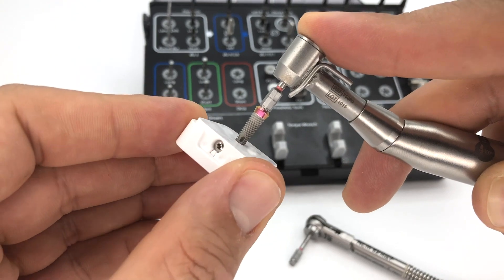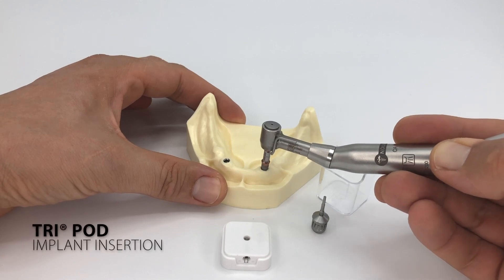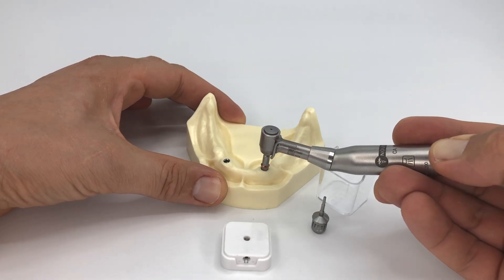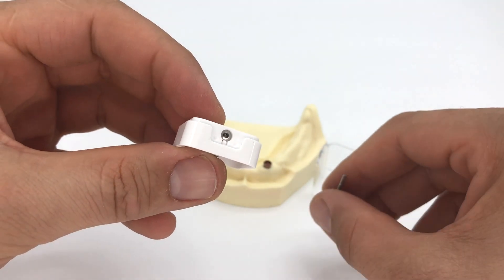Once you connect the implant driver into the implant, simply turn the tripod base away from the implant and then place the implant into the patient's mouth.